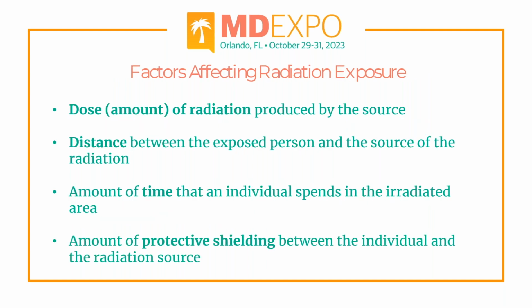Okay, so what are the factors that affect radiation exposure? This is an important thing to know if you're working in the area of imaging. The first is the dose: how much is the amount of radiation produced by that X-ray source? Just looking at the time here so that I don't run out of time. Only two minutes?